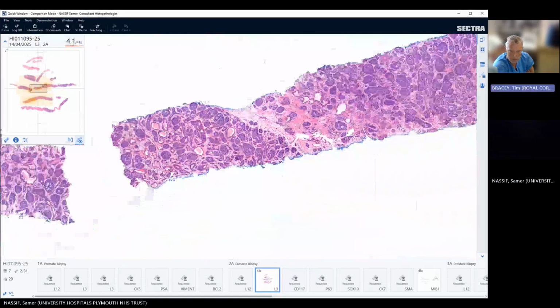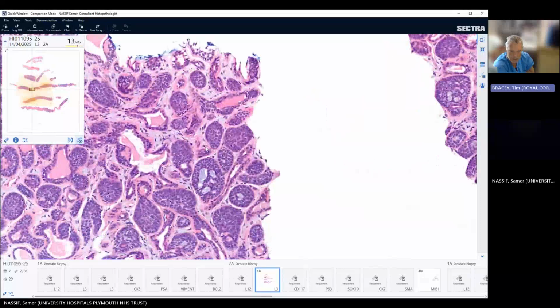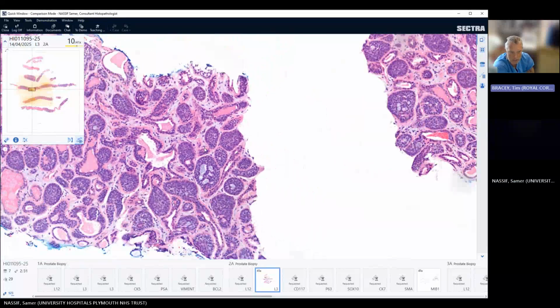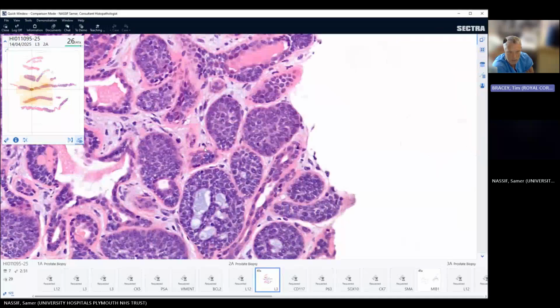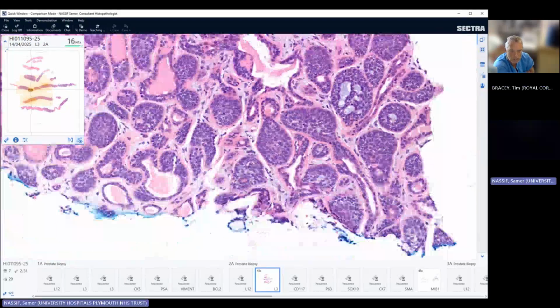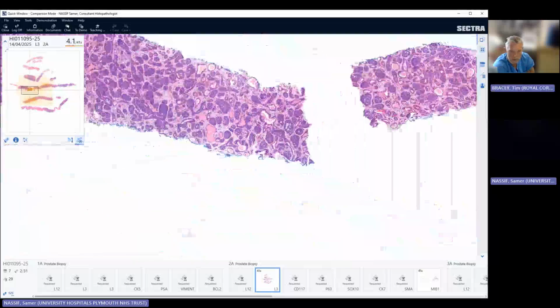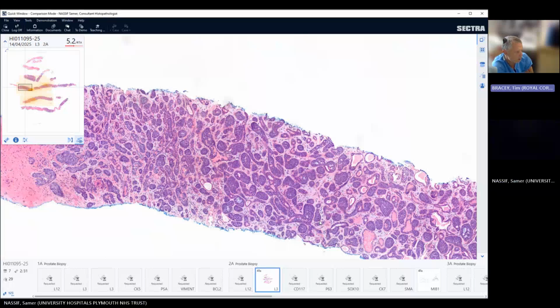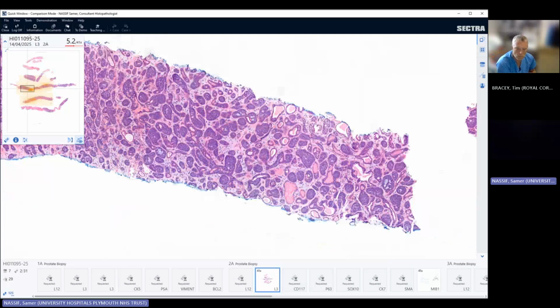The basal layer in adenoid cystic classically has quite hyperchromatic features, often with quite pale cytoplasm as well. I'm not really seeing that. Okay. Now hang on, let me show you the Ki67. I'd expect it to be around 20% with most adenoid cystics. I didn't scan the BCL2, but it was diffusely positive in this case.